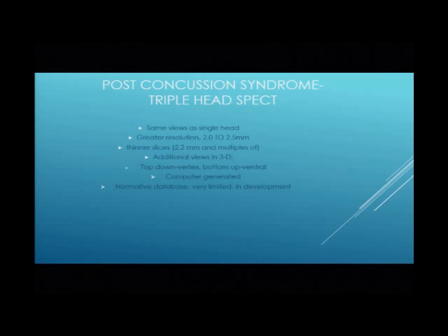So now we'll look at the modern. I'm going to take you up to modern times. Those are scans from yesteryear, but they were still better than all the other tests. Now we're going to look at a difference of resolution. What I showed you before was probably about 1 centimeter or 10 millimeters. And what I'm going to show you here is about 2 to 2.5, depending upon how they do the scan.